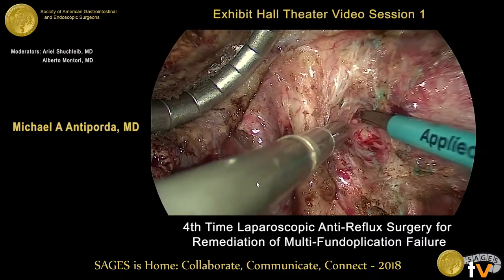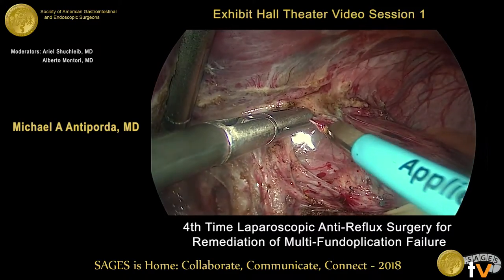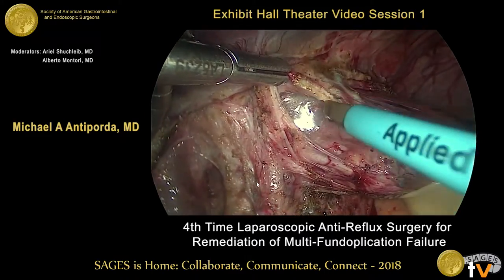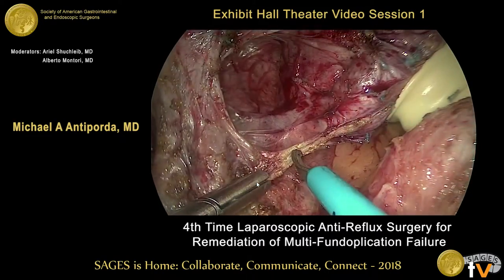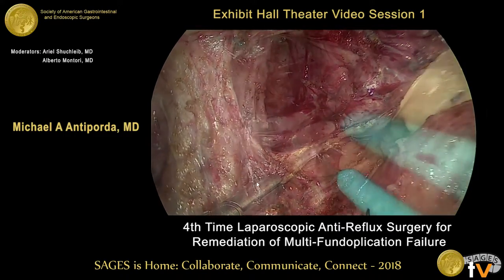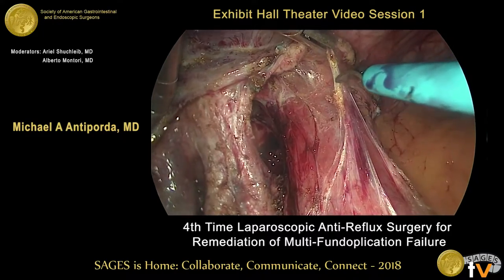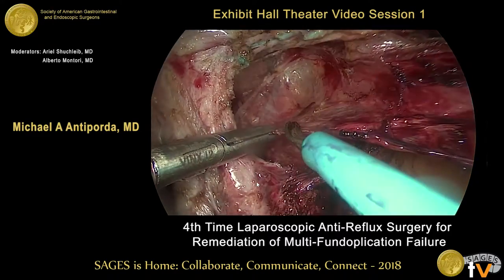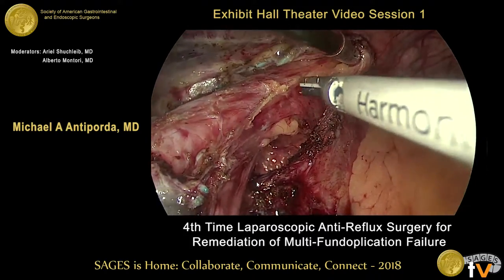The Penrose is used to retract the hiatal contents and facilitate dissection at the base of the crura. We enter the posterior mediastinum here. Dense adhesions in the mediastinum are dealt with using careful dissection with low-voltage monopolar cautery as well as an ultrasonic energy device. We perform extensive mediastinal dissection up to the level of the inferior pulmonary veins in order to maximize the length of intra-abdominal esophagus.